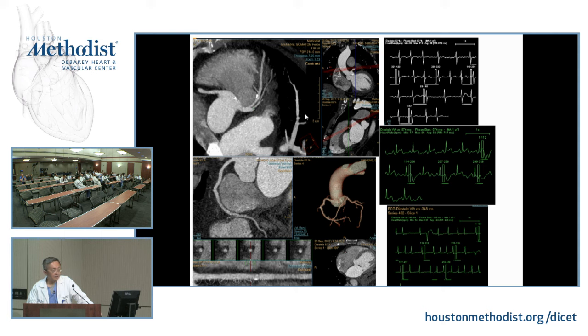So I think it's pretty clear, like the images. So it's either prospectively acquired, like in sinus, captured in systole, and the question is, is it AFib or is it in sinus? So is it captured in systole or diastole? The aortic valve is closed there, so it's probably not captured in systole. I don't know if it's completely closed or about to close. The mitral valve is not fully open, it is slightly open. Yeah, that's true, okay? And the thickness of the myocardium looks okay. Normalish, doesn't look systolic, so this is diastolic imaging, right?